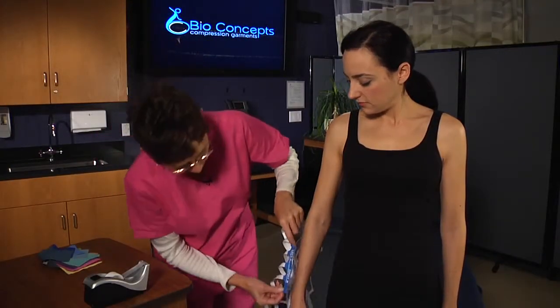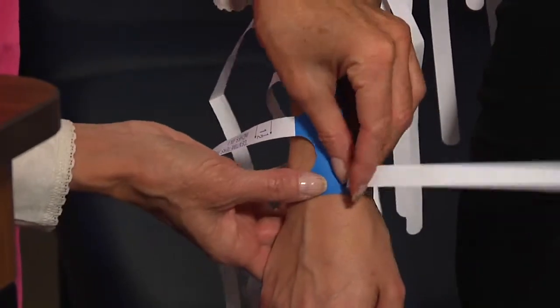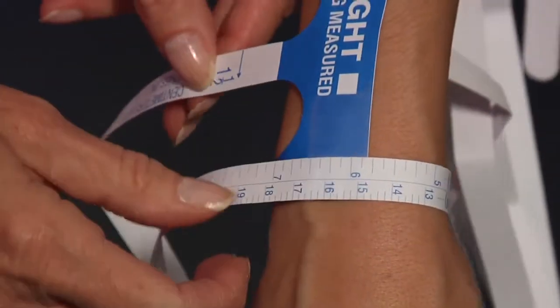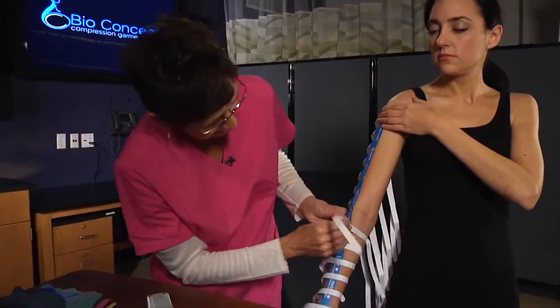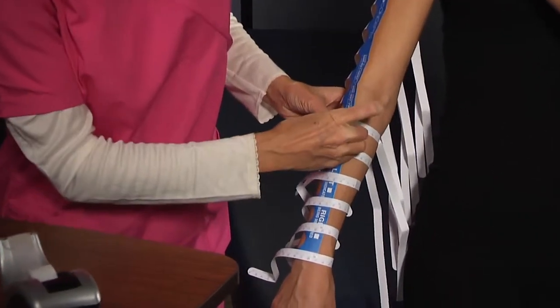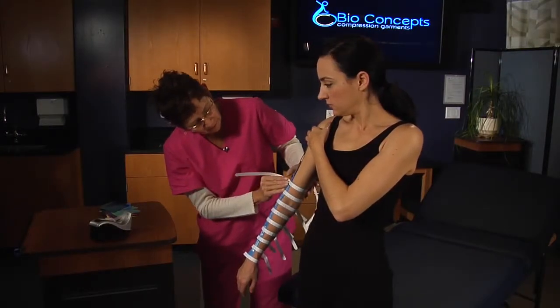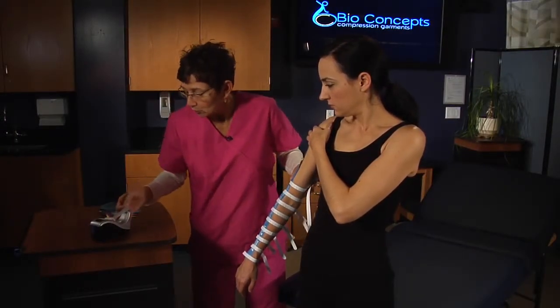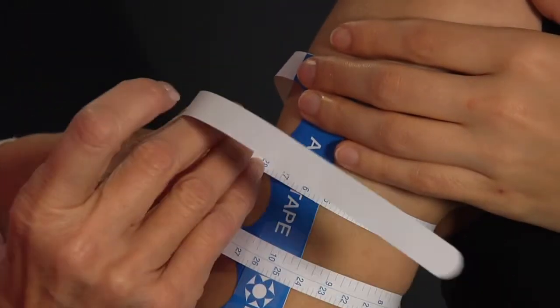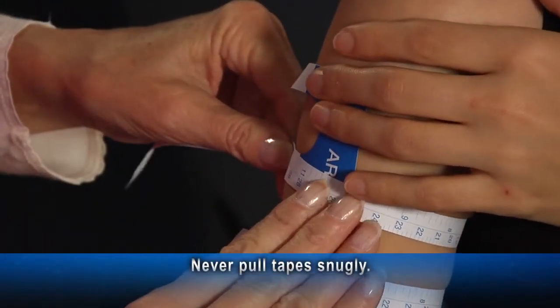Have the patient hold the arm out just long enough to get the wrist strap around the wrist and secure it to the spine of the tape. Pull the straps around the arm and secure each one as you move up the arm, being very careful to adjust each tape to make sure it is perpendicular to the arm. Also, the spine of the tape must be aligned along the dorsal and lateral centerline of the arm. Have the patient hold the arm out from the body just enough to allow you to wrap the straps around the arm and secure each one. Remember, never pull the tapes snugly.